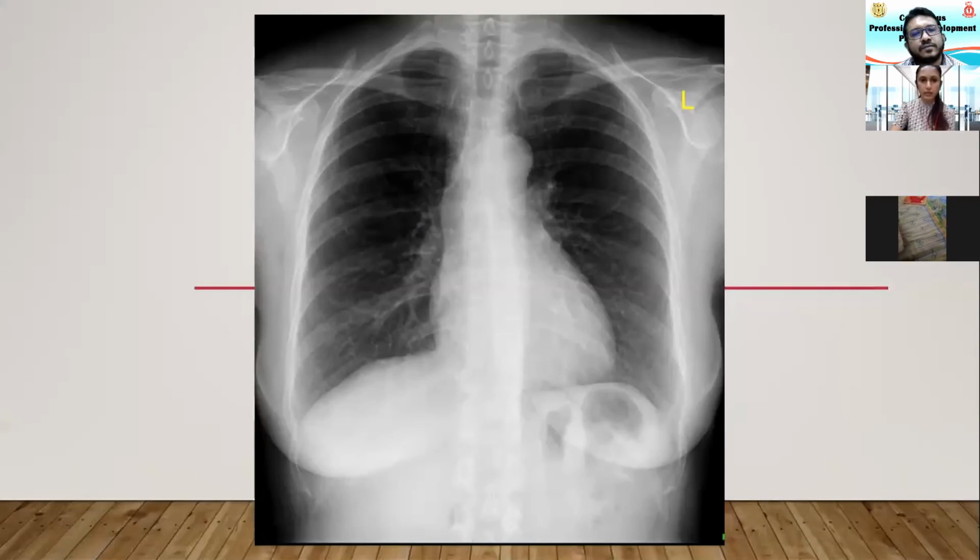Can we see fluid behind the cardiac shadow in Barrett's esophagus? Yes, yes. So not really in Barrett's, but sometimes you will see, especially in achalasia cardia, a very large opacity in the retrocardiac space with fluid levels, especially in achalasia. Barrett's also, of course, you might get, but it depends on the type of Barrett's and the level of obstruction there.